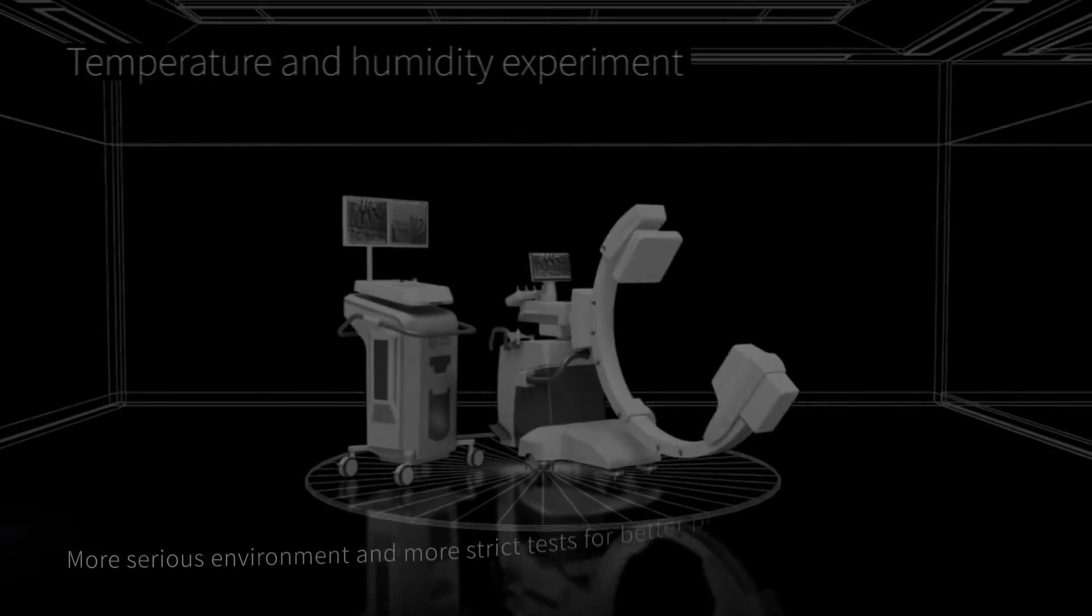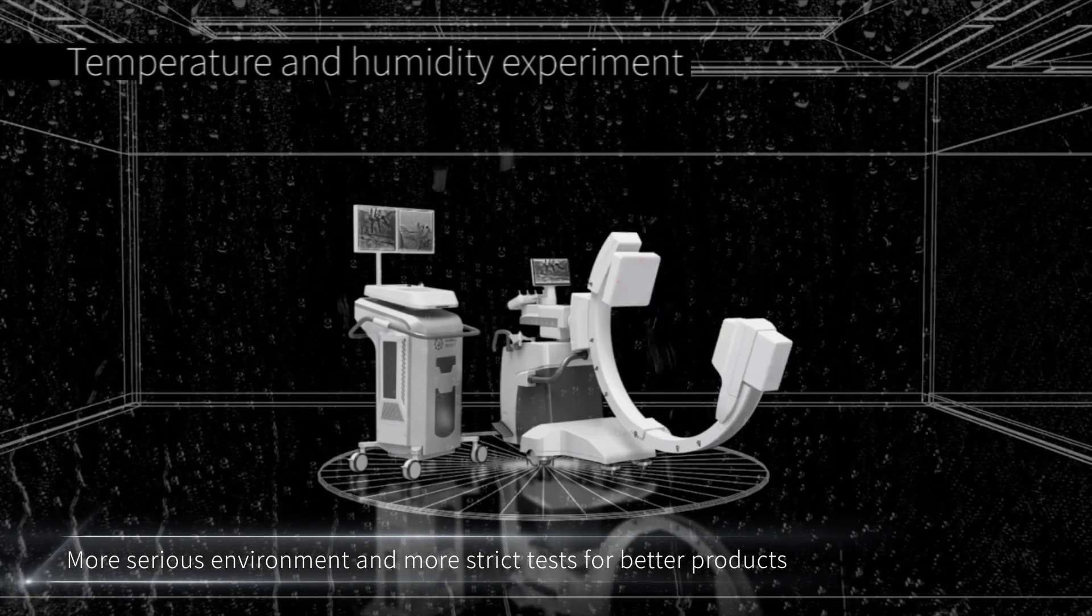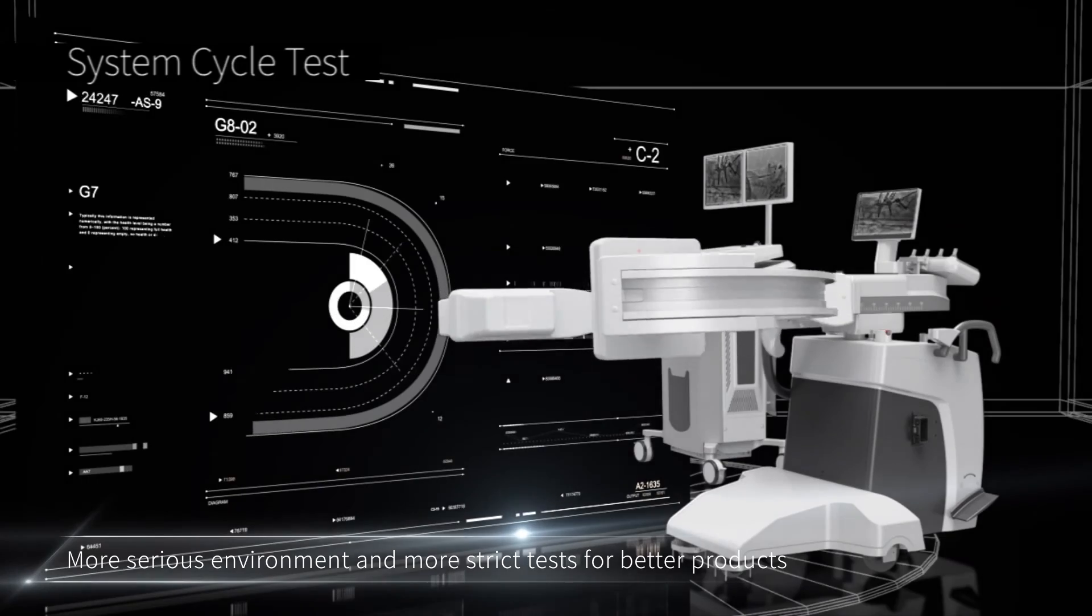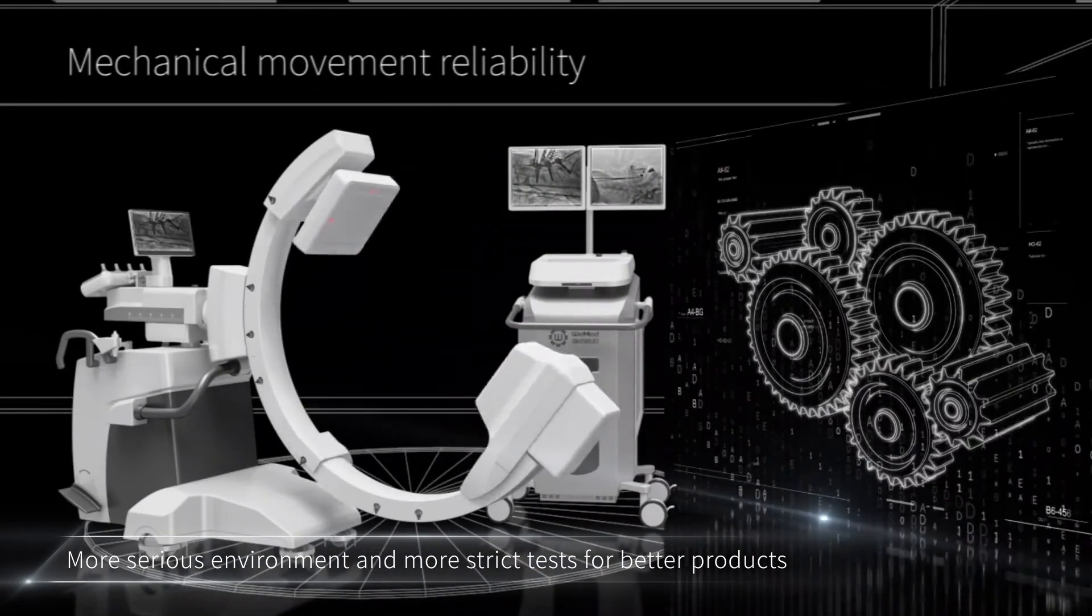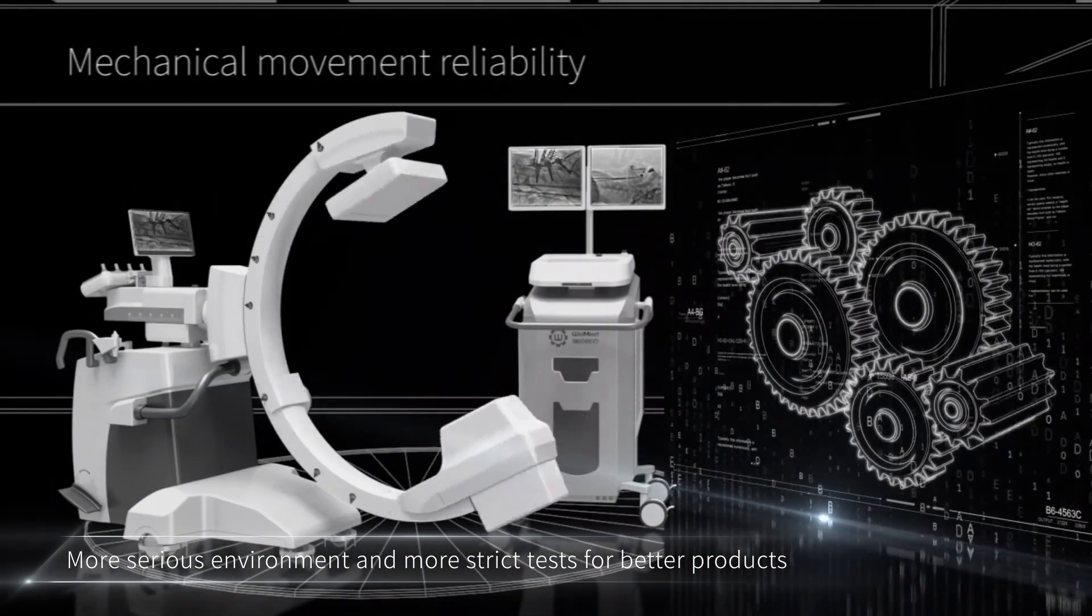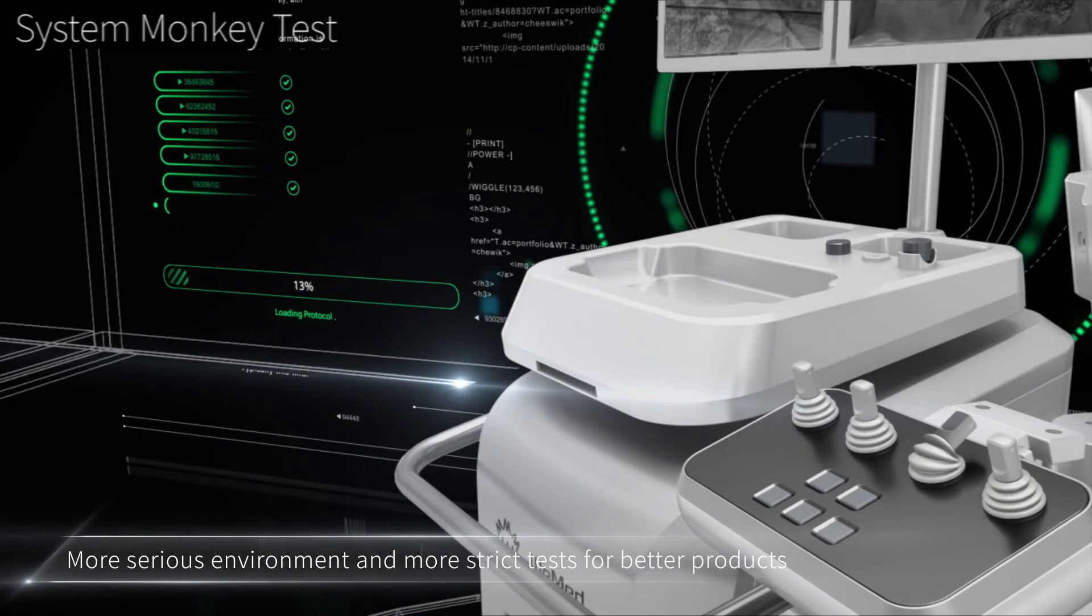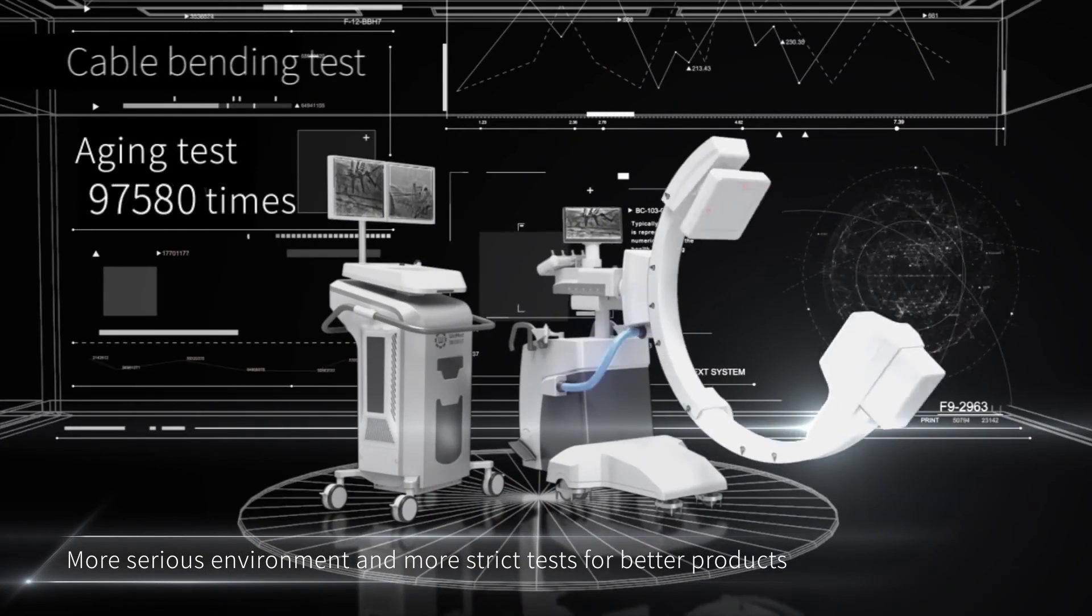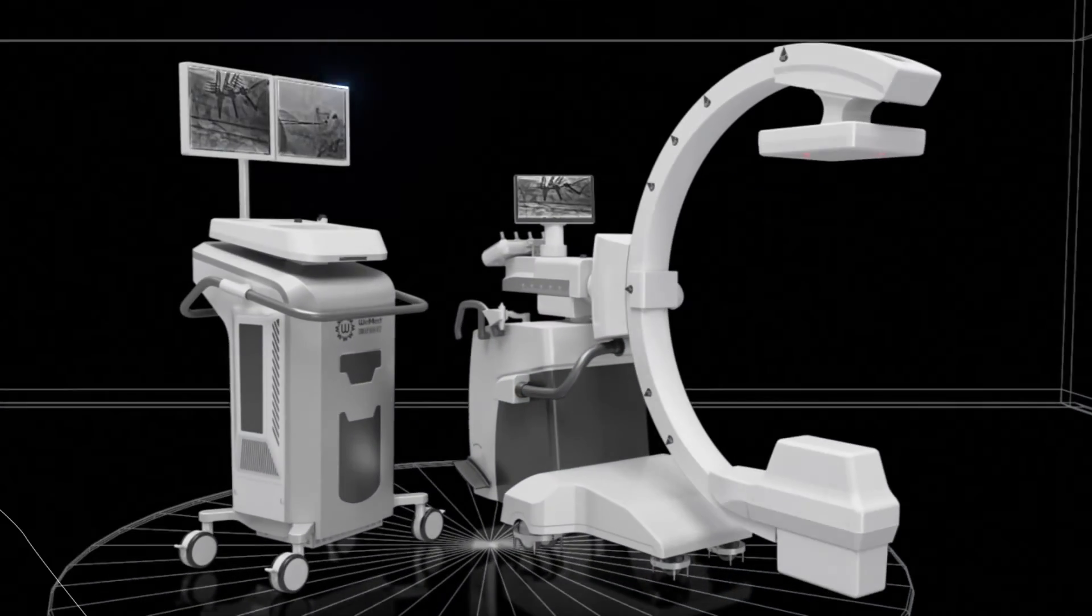ElfinBot 100 has undergone temperature and humidity tests, system cycling tests, mechanical reliability tests, flexibility tests, and aging tests.